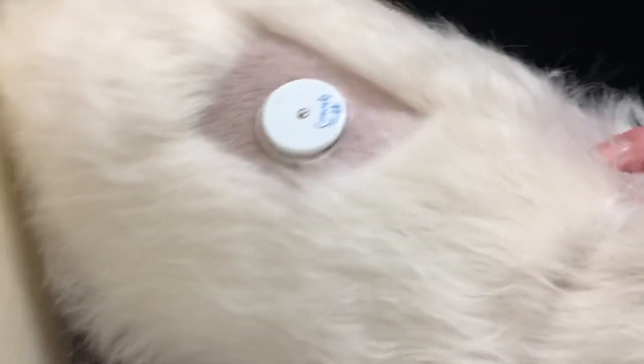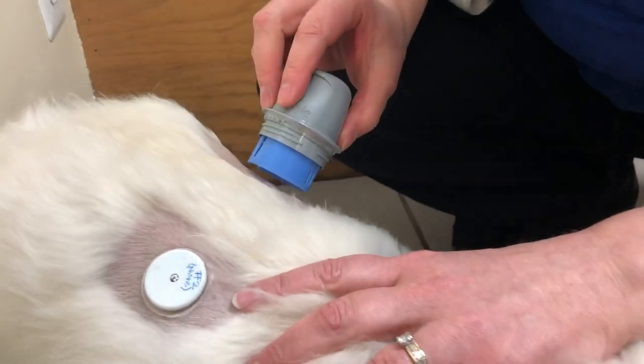So typically we shave a little spot and then we just wipe it down a little bit with alcohol, just in case there's any surface bacteria. All right. And there's one that's left over from last week, so we'll remove that one. All right. And it says we just push it in.